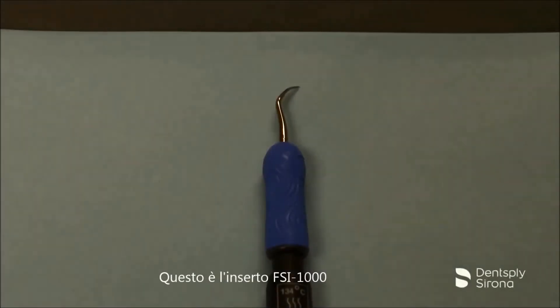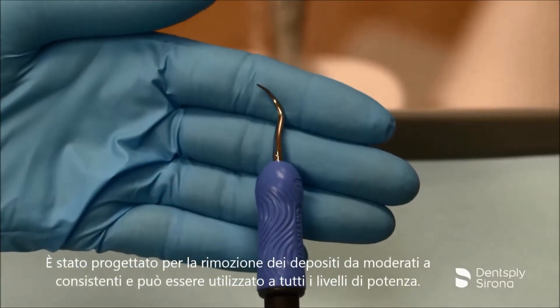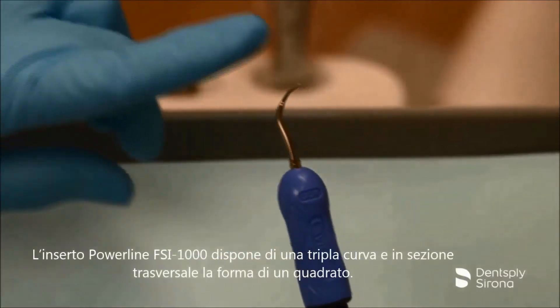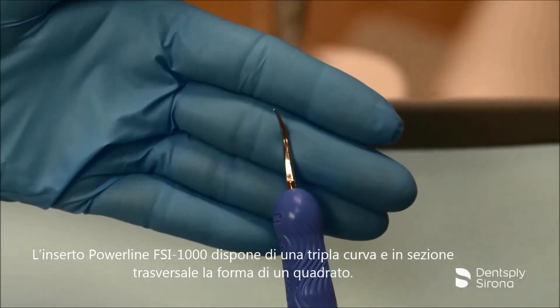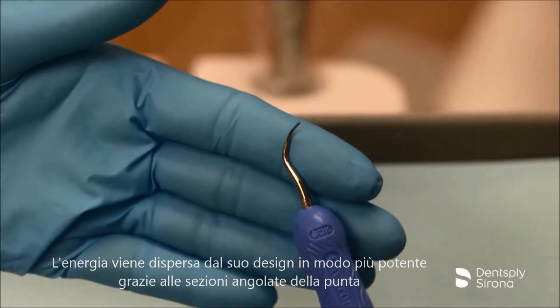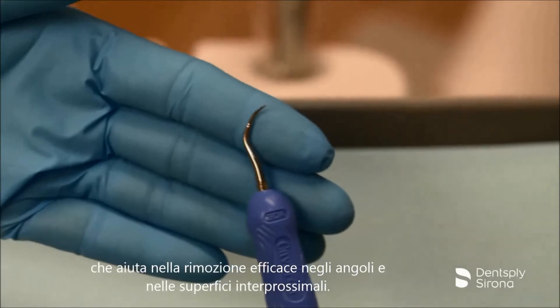This is the Cavitron FSI 1000. It is designed for removal of moderate to heavy deposits and can be utilized at all power levels. The Cavitron FSI 1000 has a triple bend and in cross section is shaped like a square. Energy is dispersed from this design in a more powerful way due to the cornered cross section, aiding in effective removal at the line angles and interproximal surfaces.